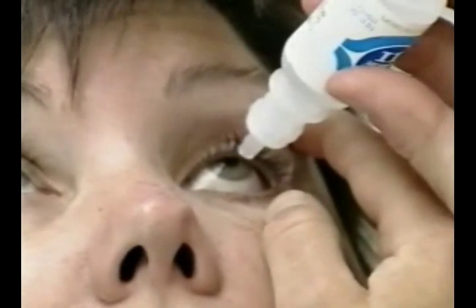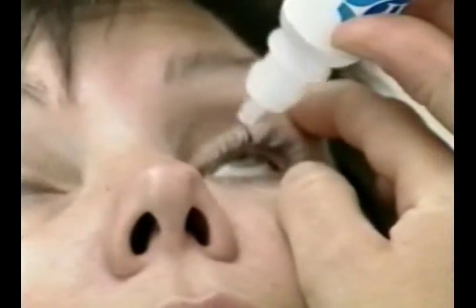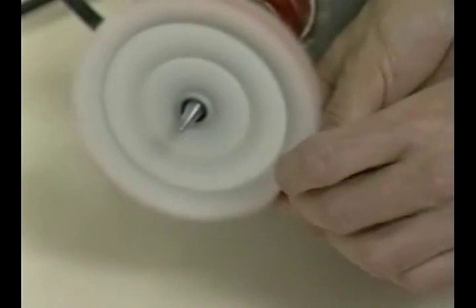It is usually recommended that a lubricant or wetting solution be used at least twice daily to assist in comfort and general cosmetics of the artificial eye. Your ocularist will recommend a lubricant for you and instruct you on how often it should be used. It is recommended that you see your ocularist at least once a year for a routine polish and checkup. At this time, your eye will be polished to eliminate any buildup that may have accumulated on the eye, as well as any surface scratches. It is also a good time to discuss how the eye is fitting and any other concerns you may have.